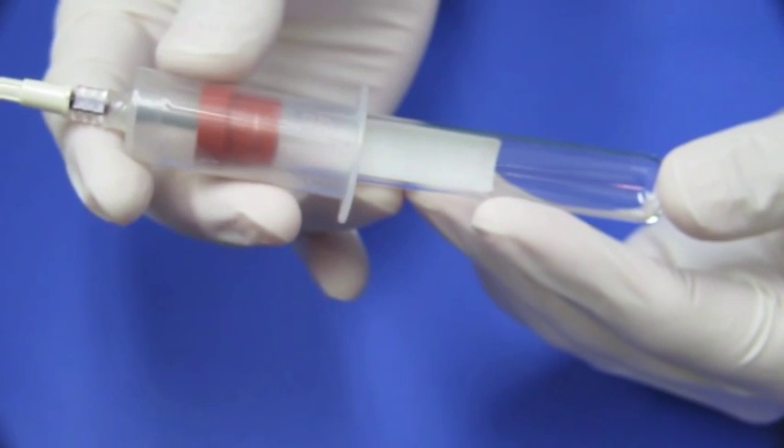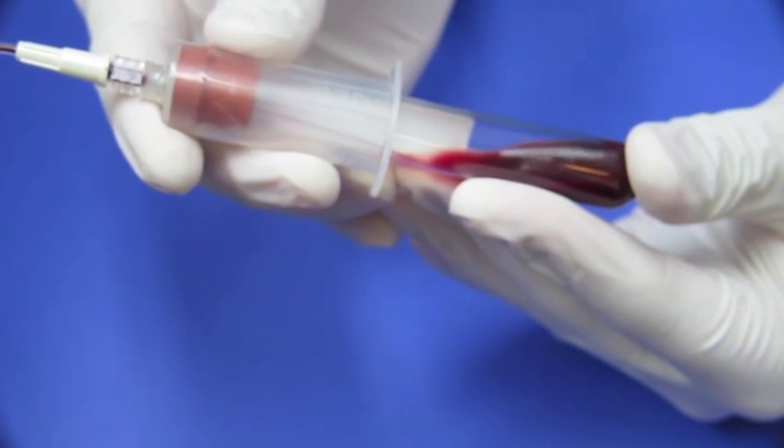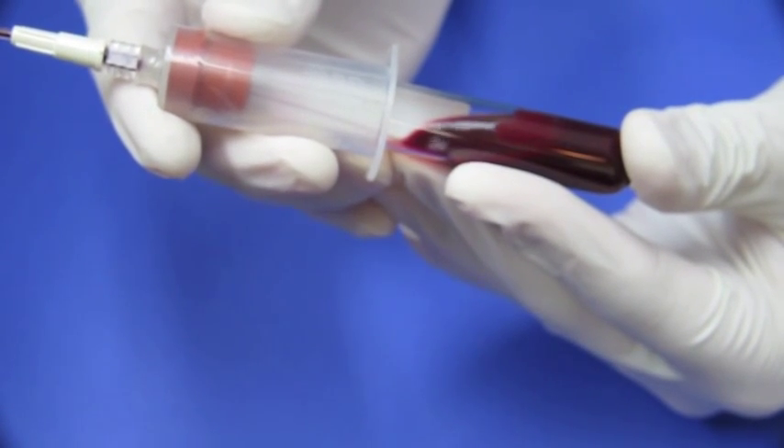Then you can draw the red tubes, which don't have an anticoagulant within them. You don't need to agitate those at all — in fact, be a little careful with them. Draw them as quickly as you can so they don't clot before you get them into the centrifuge.